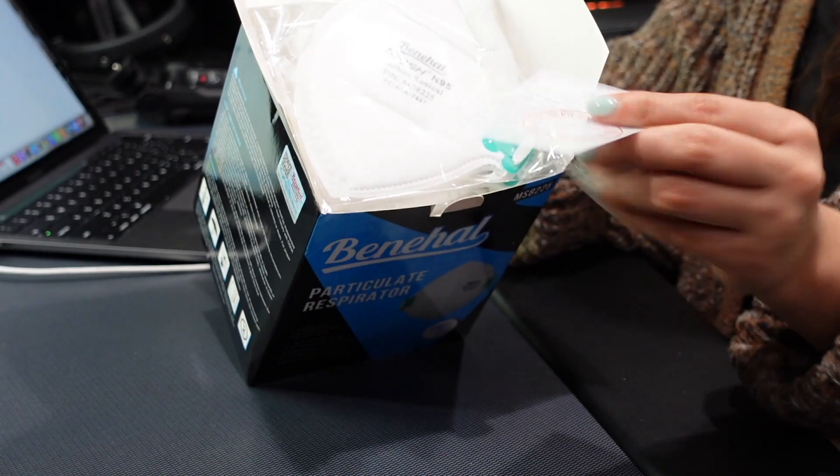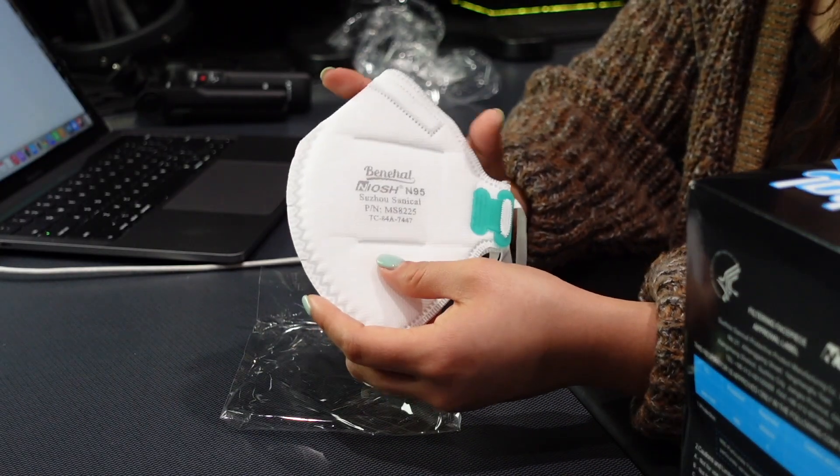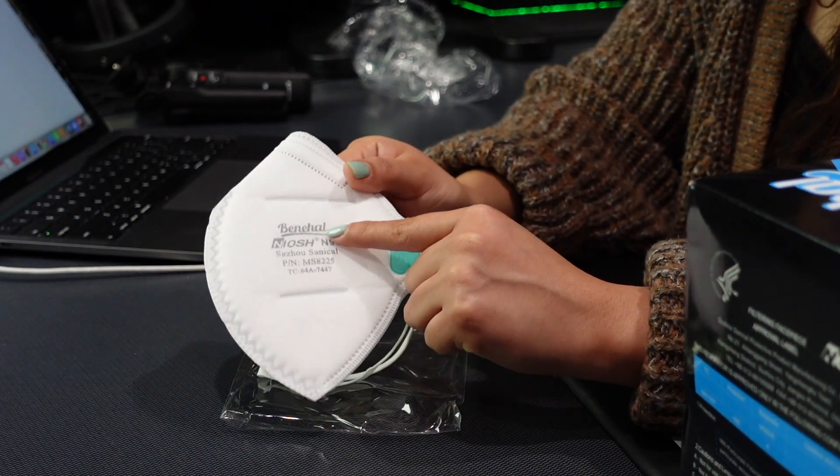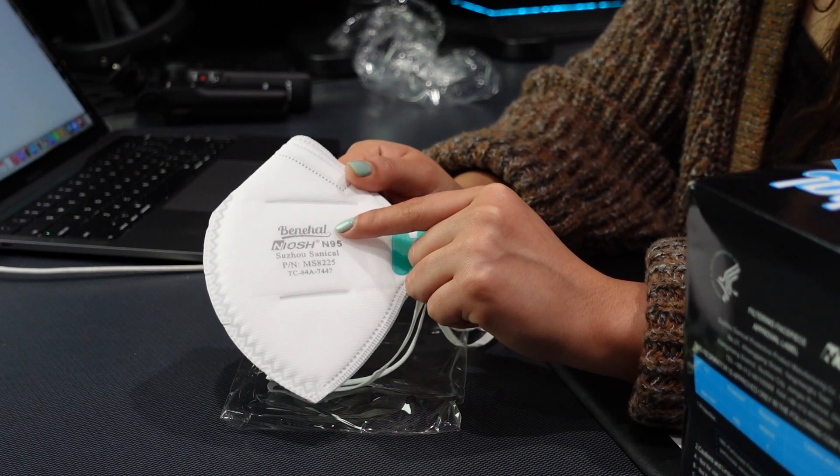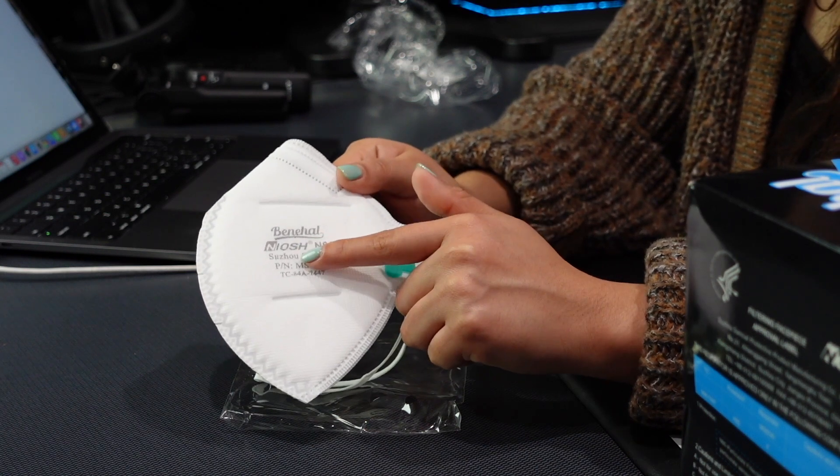Let's go ahead and open the box and see how the mask looks. This is how it looks when you open it up — it comes with a certificate. One thing I've noticed while doing these mask reviews is that it's good that they are individually wrapped, but I feel like I've been getting a lot more plastic smell, which could be due to the plastic wrapping. Just by looking at it, the mask does feel very well constructed. It provides the N95 requirements: the brand — this is Benehal — the NIOSH approval stamp along with the TC approval number. The mask also provides a nose foam, which basically helps you have a better seal.